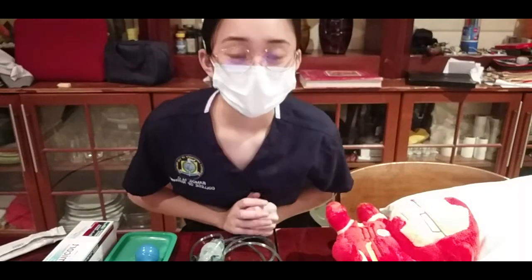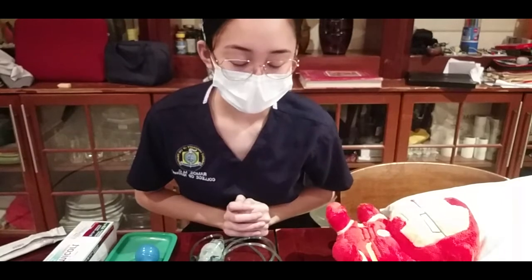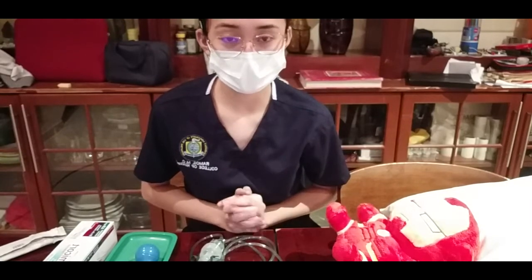So good morning, ma'am. I am Judith Ramos, and today I will be your student nurse and I will be performing the oxygen therapy checklist. So first off, we are going to start with our assessment.